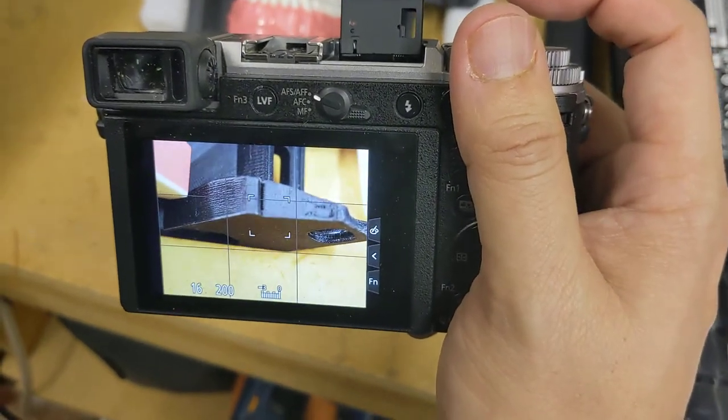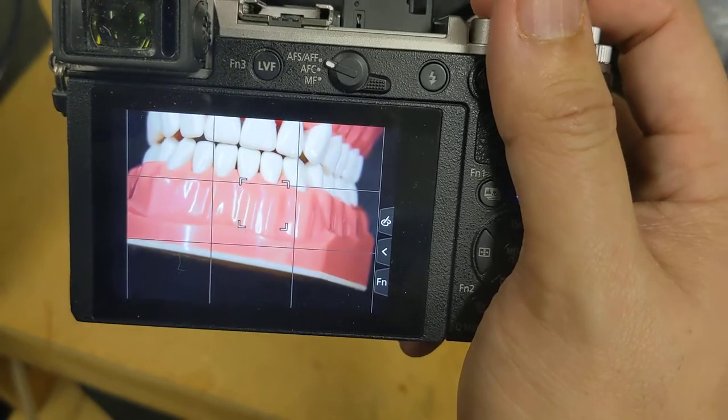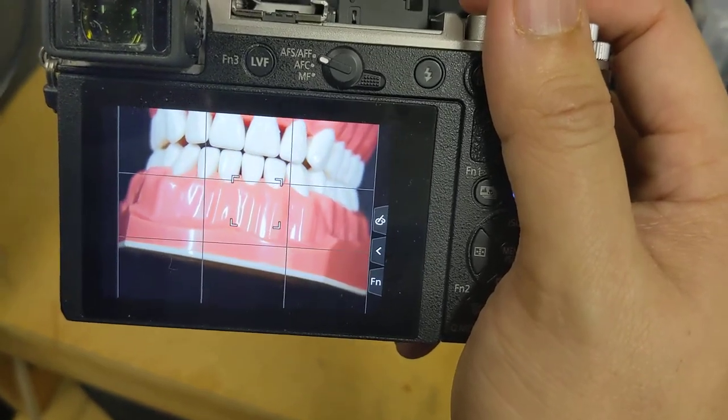Hey guys, this is Vu, and this is how we can get some better autofocusing performance out of our GX8 and GX9 cameras.